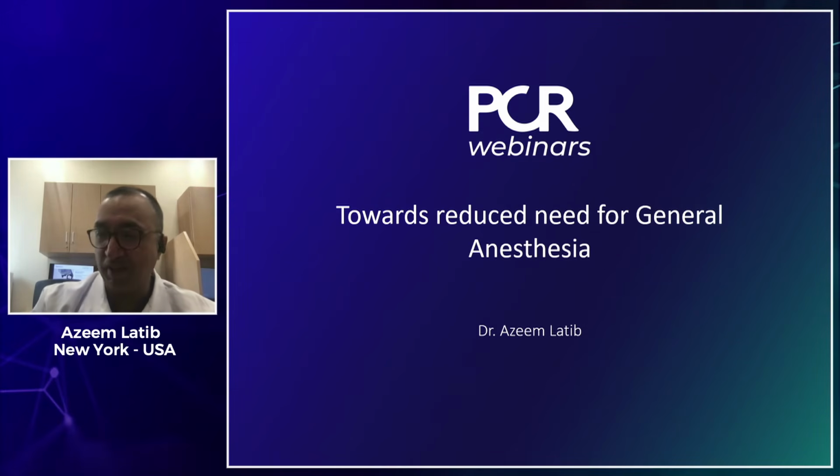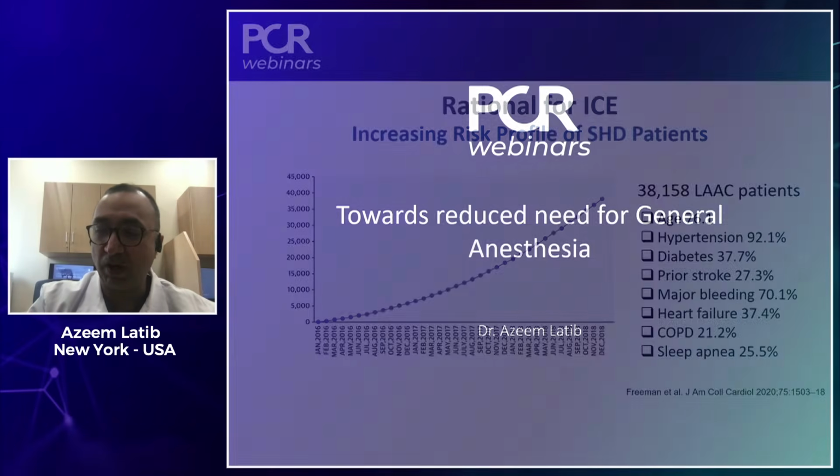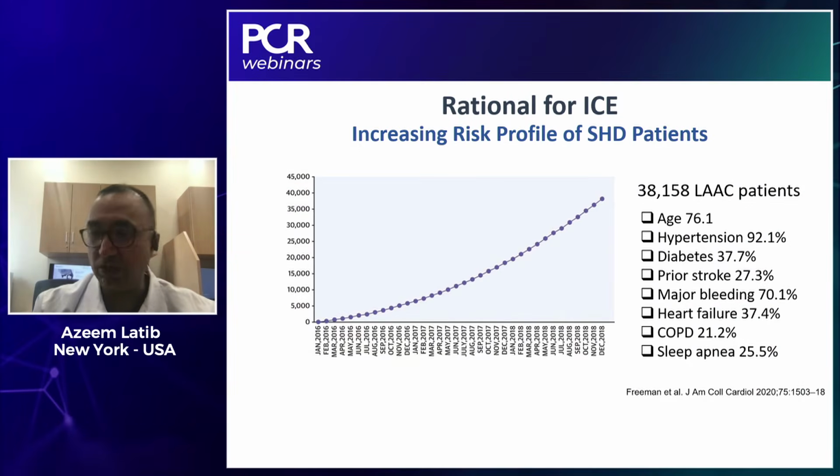That doesn't, though, mean I'm trying to move away from my echocardiography colleagues, because what I'm about to show you, I think, as far as ICE, can't be done without working together with an echocardiographer. So, all the ICE cases we do here at Monty are done with one of our echocardiographers, and usually Dr. Ho, who's a real expert in it.